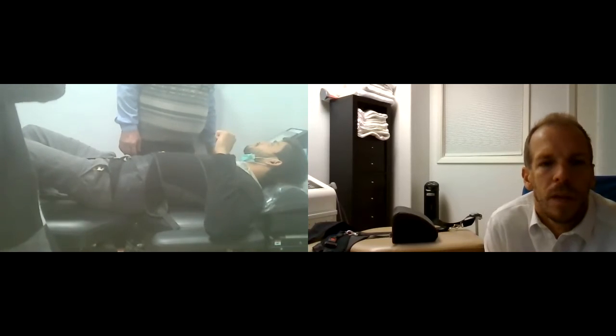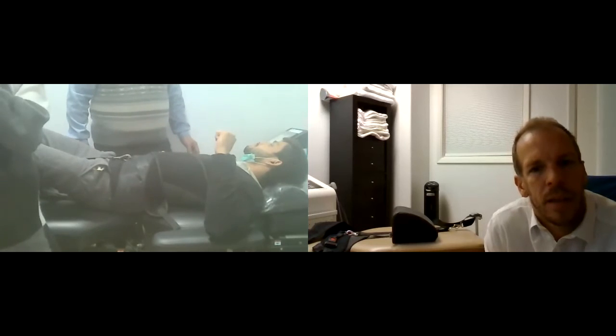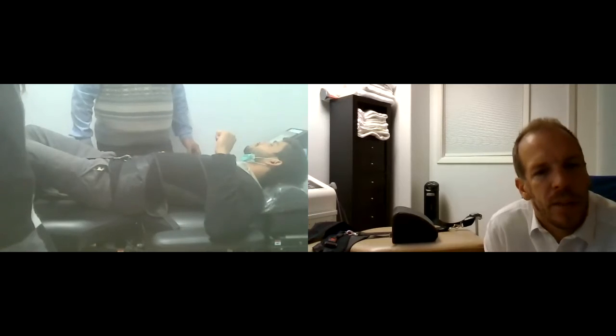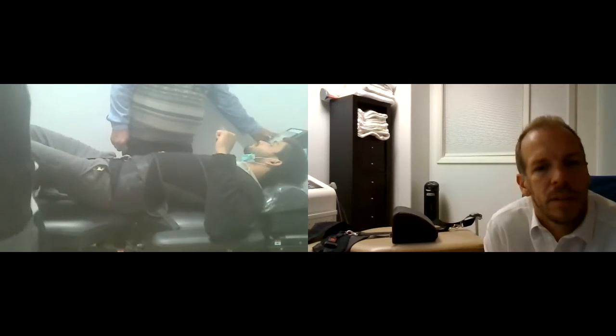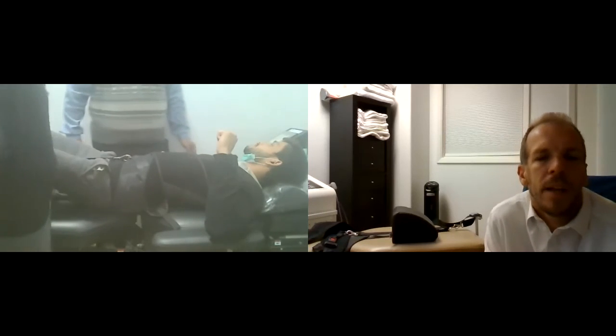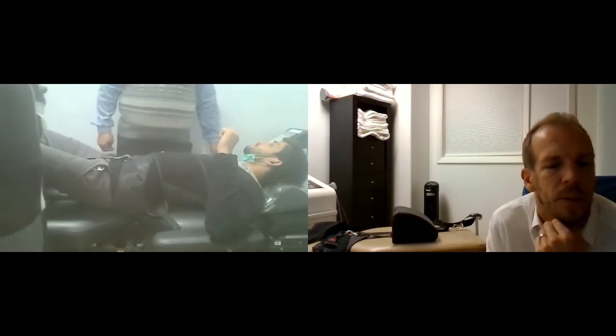Now the estimate is 16.6 minutes, so about a 16-minute treatment. Put in 3 cycles, and now it says 19 minutes. So do you see how adding 1 cycle adds about 2 to 3 minutes per treatment?